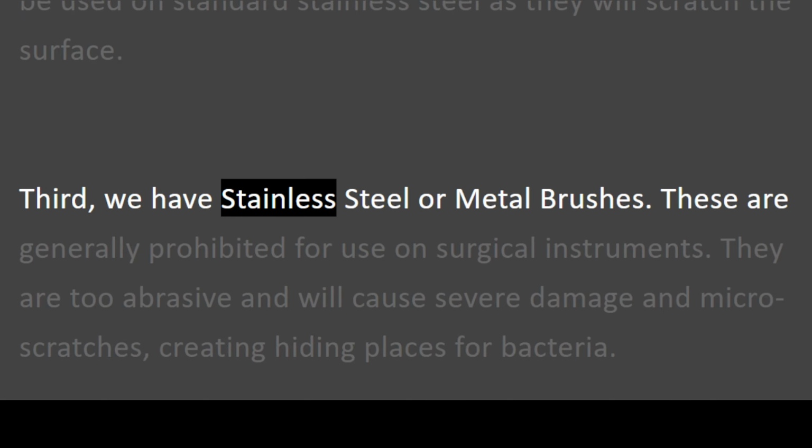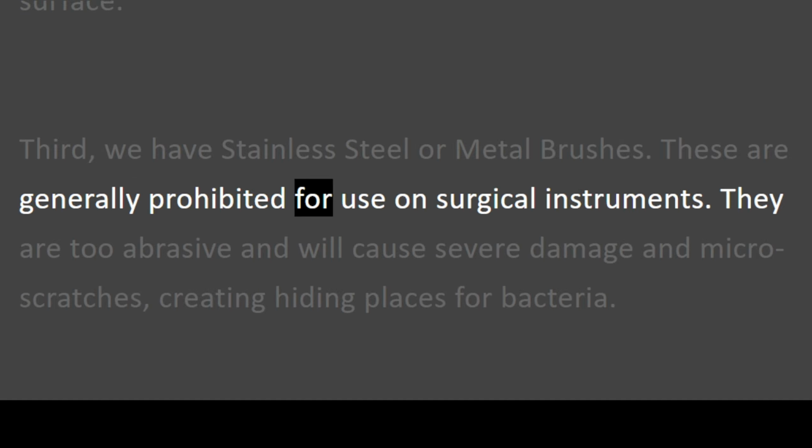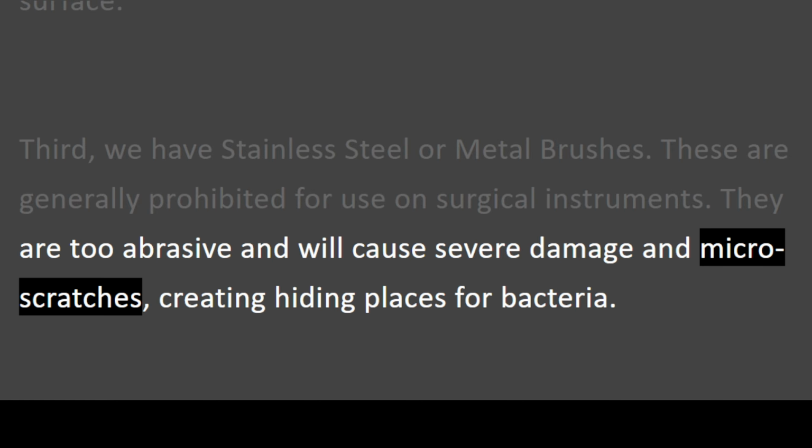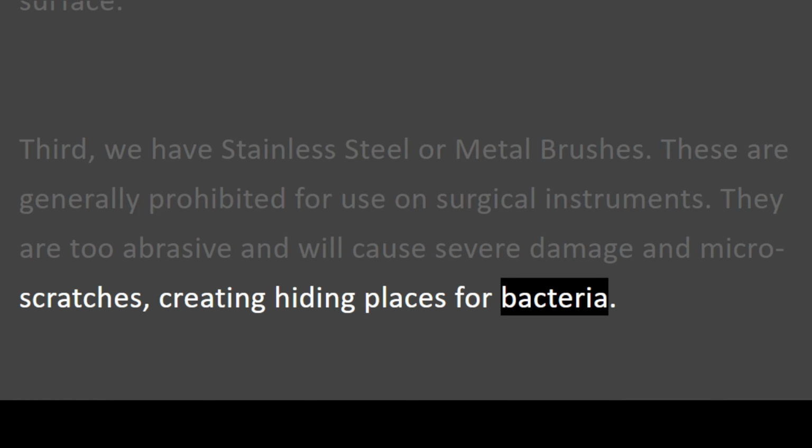Third, we have stainless steel or metal brushes. These are generally prohibited for use on surgical instruments. They are too abrasive and will cause severe damage and micro scratches, creating hiding places for bacteria.